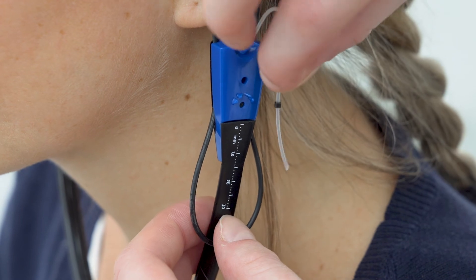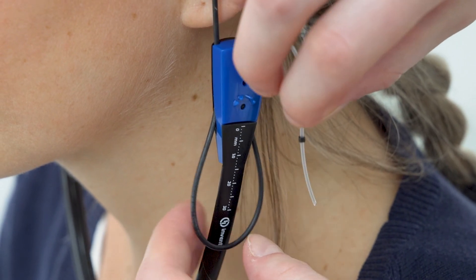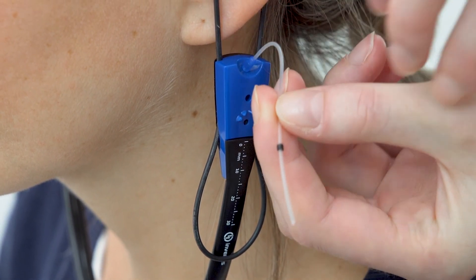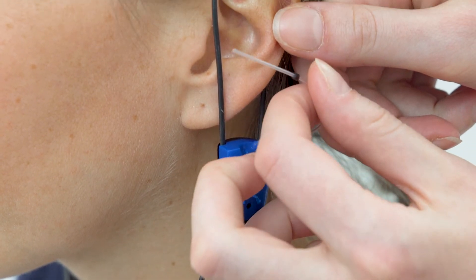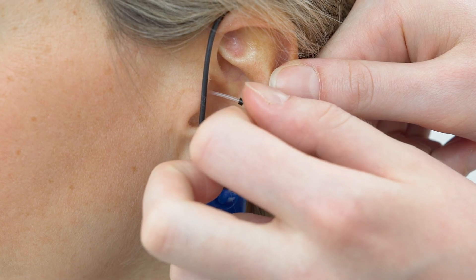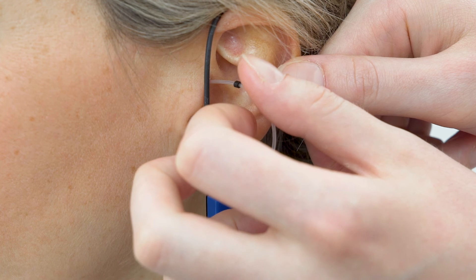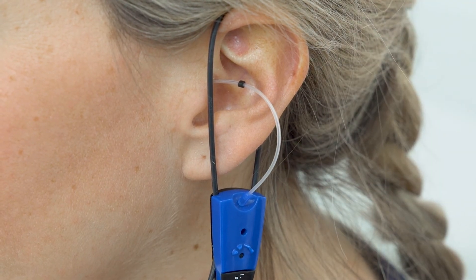For unaided measurements, the patient should wear no hearing aid and the probe tubes should be inserted in the ear canal reaching a few millimetres distance from the eardrum. Use the ruler printed on the headset and the black ring on the tube to adjust the average depth of insertion. For adults, it is usually suggested to be about 27 millimetres.